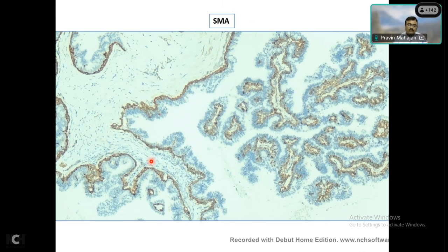So you can start to have more of a myofibroblastic proliferation, and SMA will be expressed in those myofibroblasts around these layers, and then you start to have problems interpreting the SMA. So always pay attention when you are interpreting SMA in these myoepithelial cells.